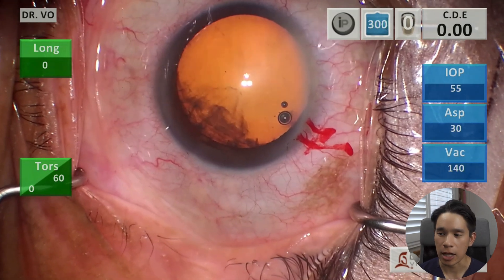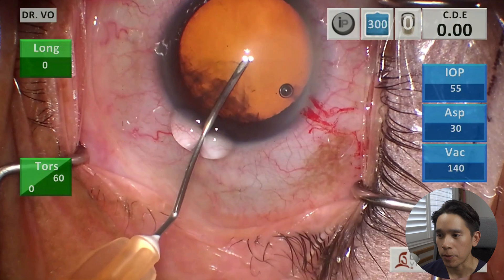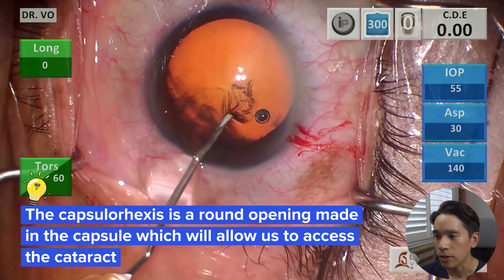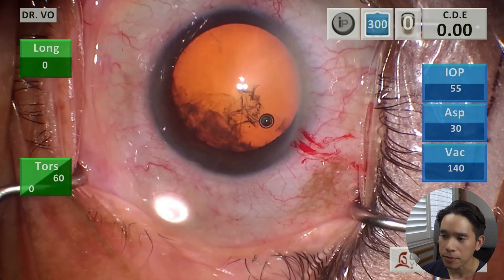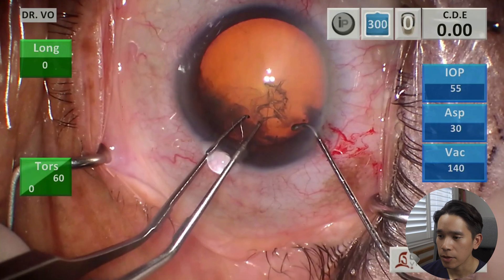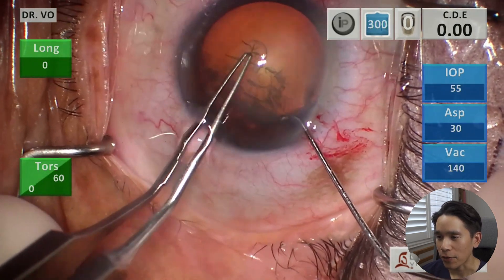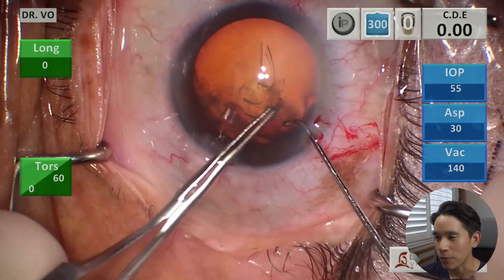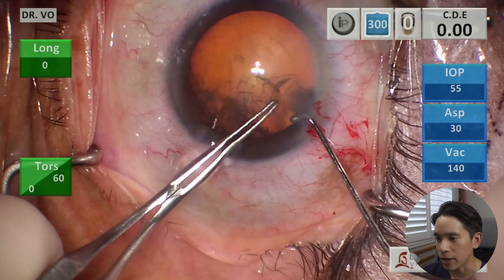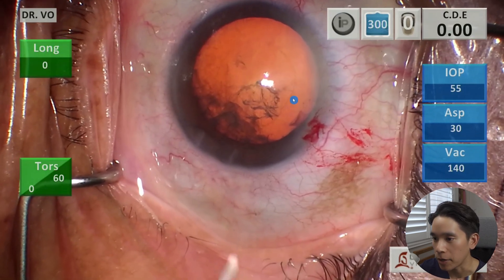Going back to the previous analogy about the M&Ms — the M&M has an outer shell, and so we want to make an opening into that shell. At this step, we're making what's called the capsulorhexis. This is a round opening where we kind of peel a circular opening in the outer layer, and this will give us access to the cataract which is underneath. I'm almost done with the capsulorhexis, and I'm going to outline it for you with my cursor here — you can see the opening to the cataract.